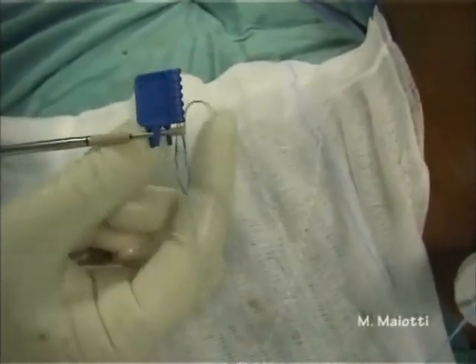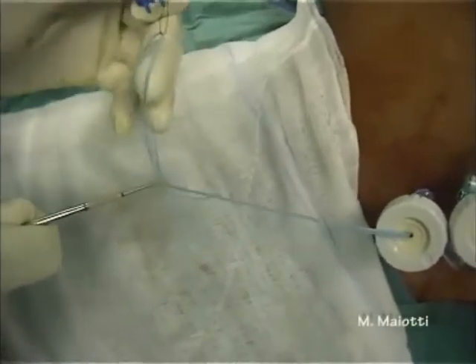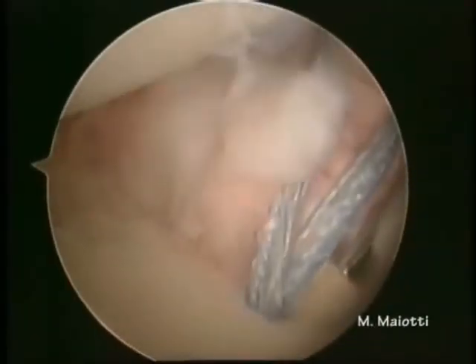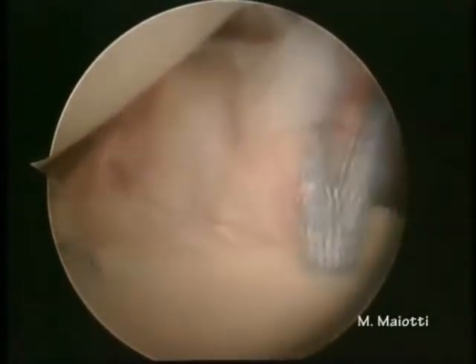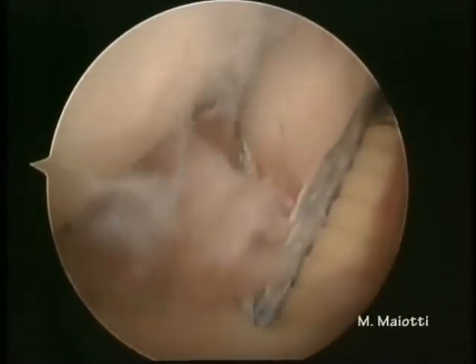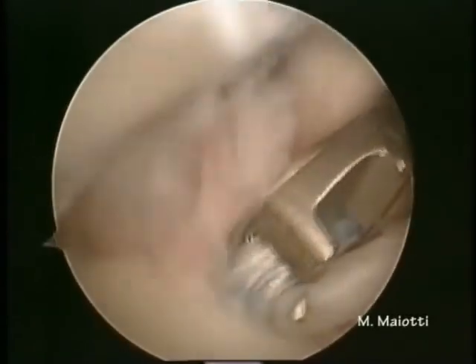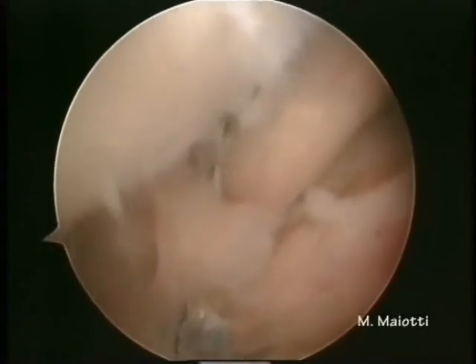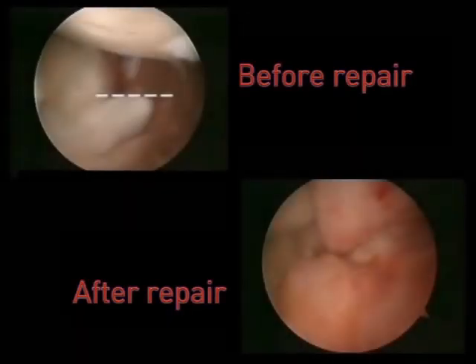The free ends of the tape are passed through the anchor islet. The anchor is then pushed along the tape, with care taken to maintain the two ends parallel. The anchor is pushed into the joint towards the bone hole. At this point it is important to control the tendon tensioning, holding the tape ends in traction. This step has to be done with the arm in neutral rotation. We can clearly see the complete closure of the anterior pouch.